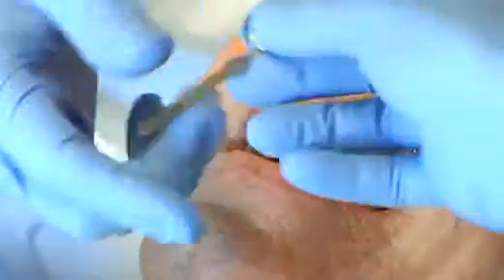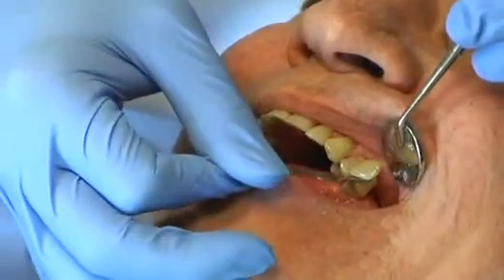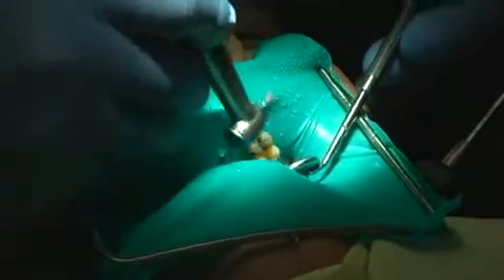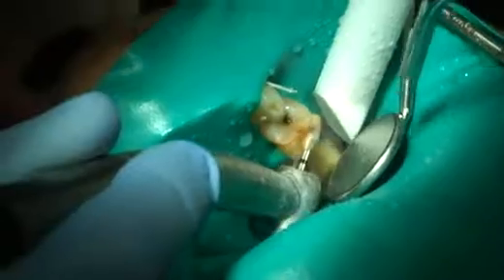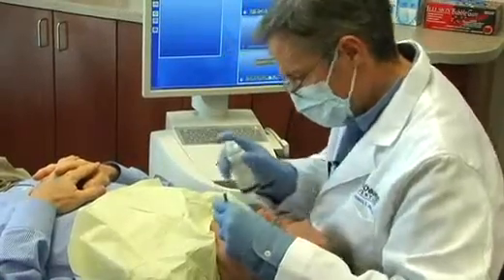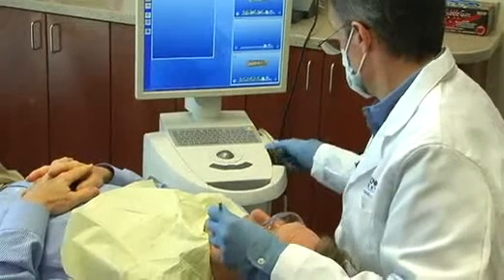First, a shade is taken of the neighboring teeth to establish the necessary color and value of the new CEREC Connect restorations. The teeth are then prepared. Sirona OptiSpray is applied to enhance the quality of the digital impressions.